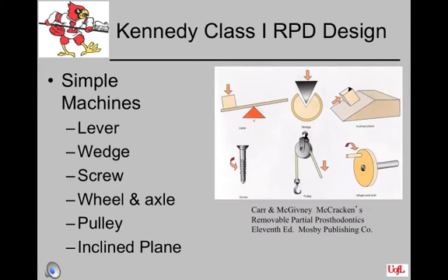RPDs are designed using some of the basic principles of simple machines and the rules of physics. Some of these simple machines are listed above. They are the lever, wedge, screw, wheel and axle, pulley, and inclined plane.